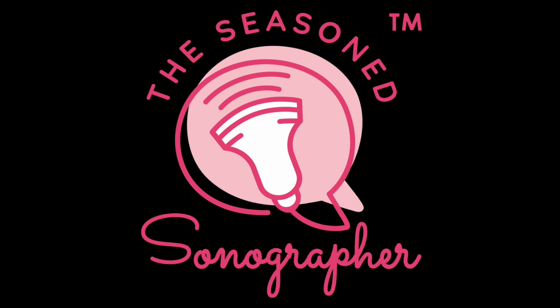Why does the first trimester ultrasound matter? It is crucial for confirming pregnancy, viability, location, and dating. First trimester ultrasound is important for establishing that gestational age and having a good, solid due date, or EDD, especially for tracking the pregnancy growth later on in the third trimester. A lot of times, if the patient has any comorbidities like chronic hypertension, gestational diabetes, pre-existing diabetes, and even obesity, that is an indicator for those third trimester growth scans.